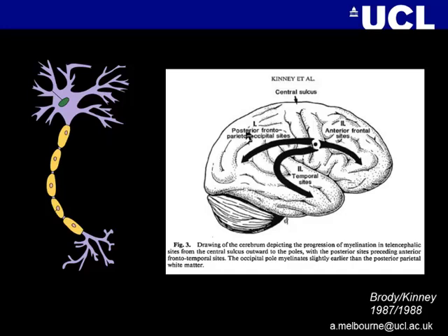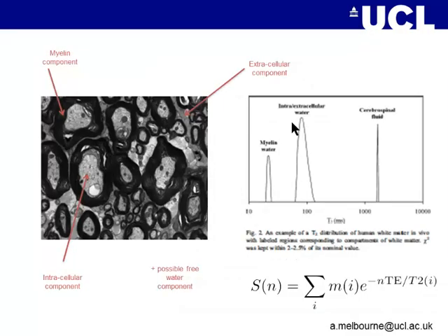It starts with the very long tracts from the posterior all the way to the anterior frontal sides, and then slowly extends through the temporal sides. So we need to have maybe a better method to just look at myelin.